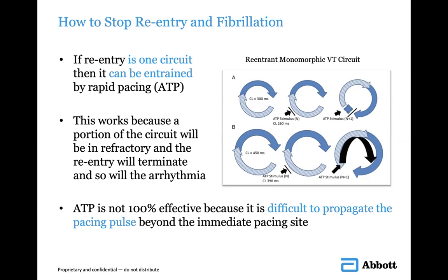So okay, AJ. Yes, sir. Can you explain the difference between burst and ramp? He's talking of the trains of stimuli. Oh, gotcha. Yeah.